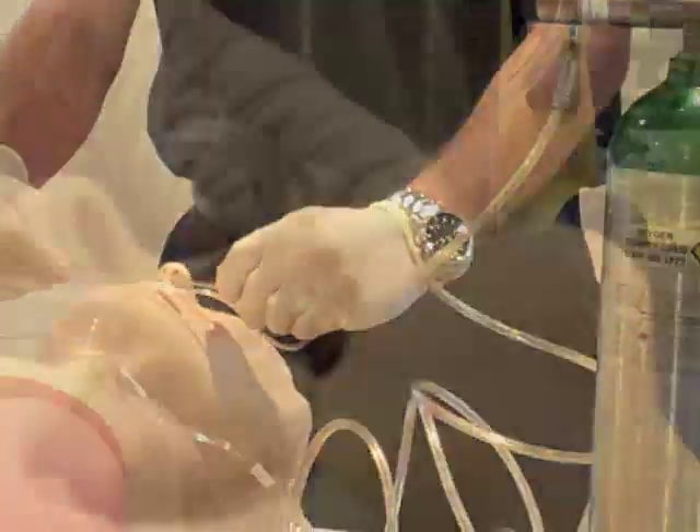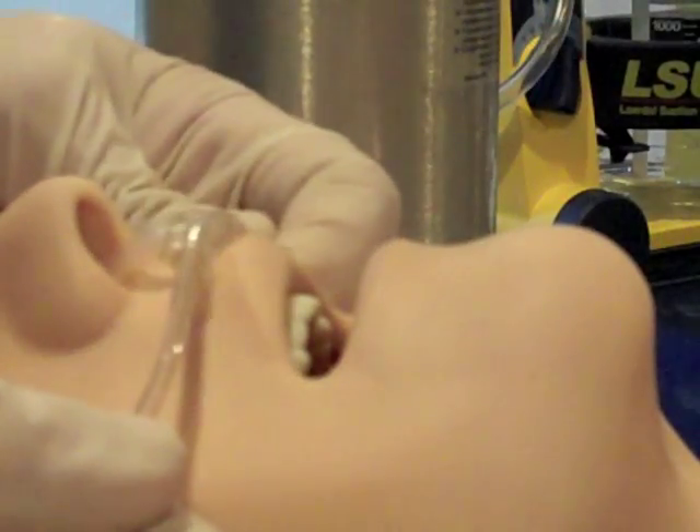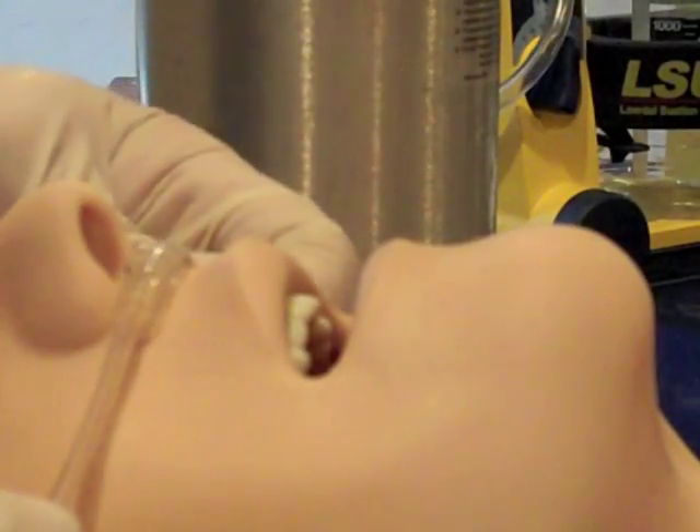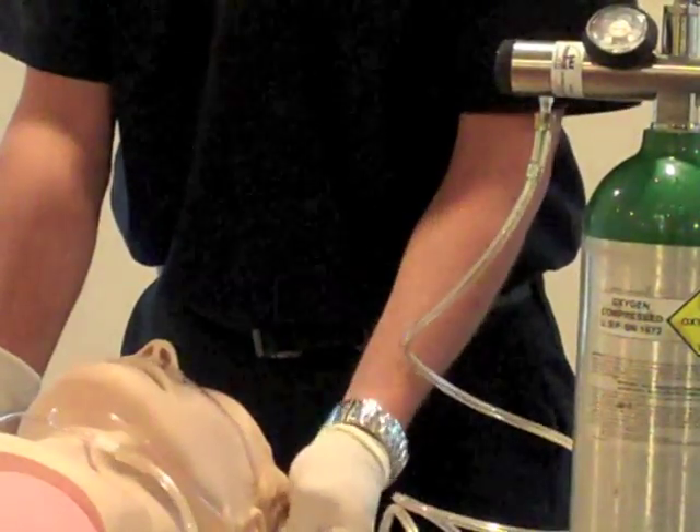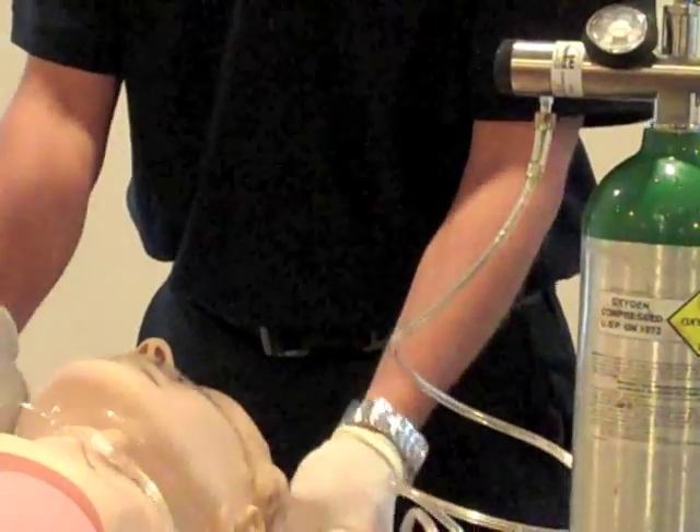Apply the nasal cannula to the patient by inserting the prongs into the patient's nares, ensuring they are curved downward. Hook the cannula tubing over the patient's ears and then adjust the slide to secure it under the chin.